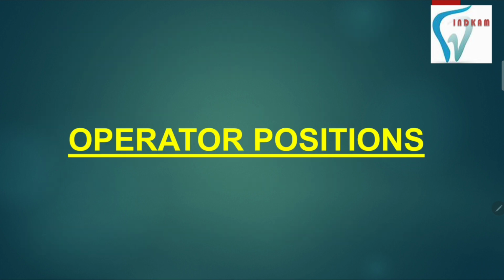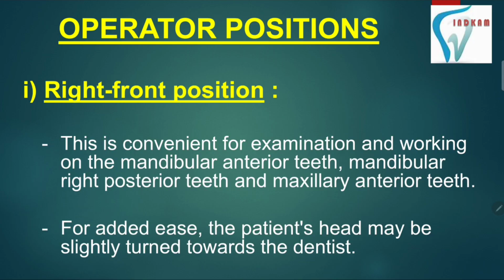Let's talk about each position in detail. First of all, right front position. This position is convenient for examination and working on the mandibular anterior teeth, mandibular right posterior teeth, and maxillary anterior teeth. For added ease, the patient's head may be slightly turned towards the dentist.